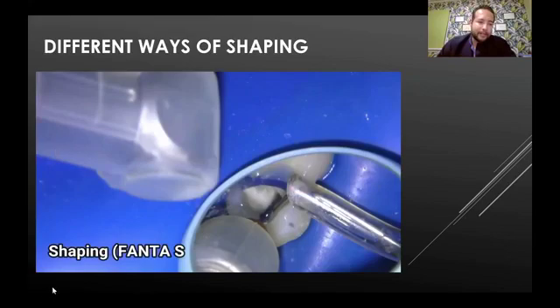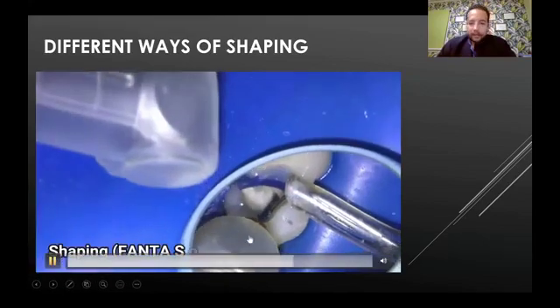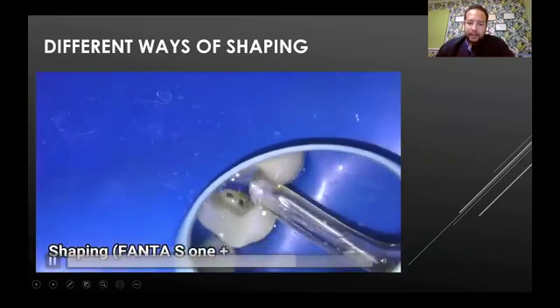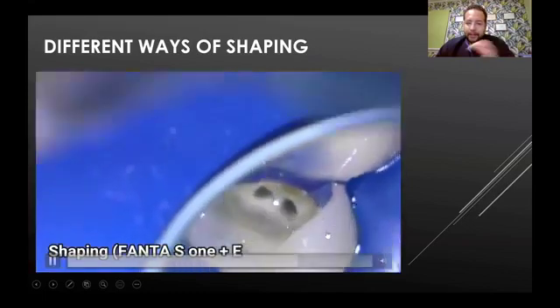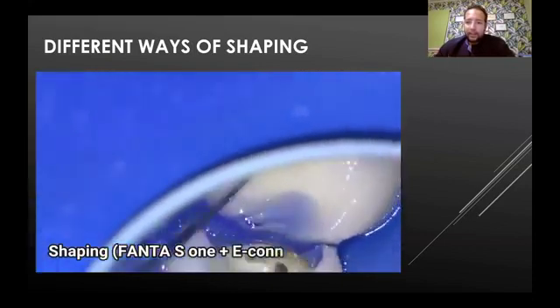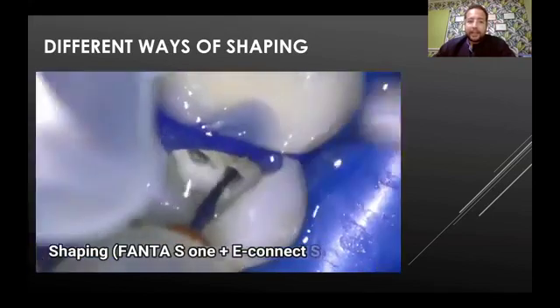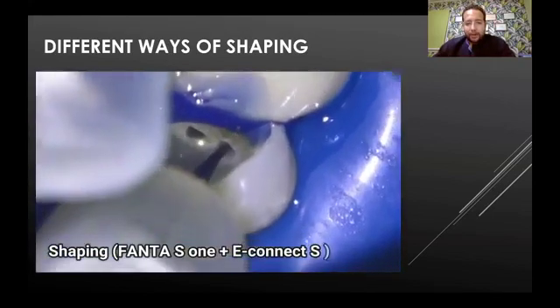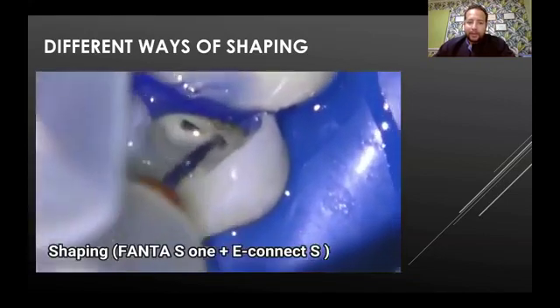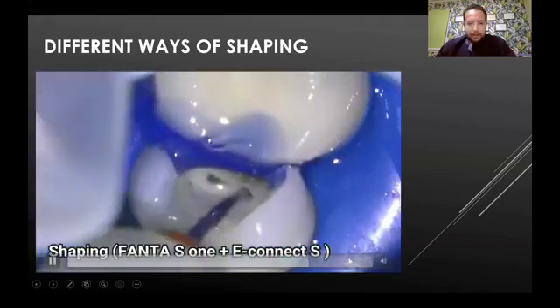We can see here. Look how the metal tip pushes the irrigant, and the plastic cap connected to the high volume suction will remove the irrigant and the debris, refreshing the irrigant instantly in the canal. Look, when I use it alone, without the ordinary technique, without refreshment, the debris accumulates. We can see this in another video more clearly.